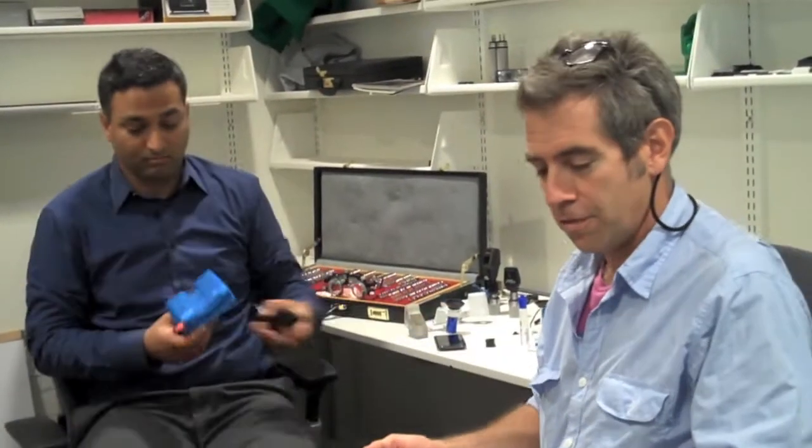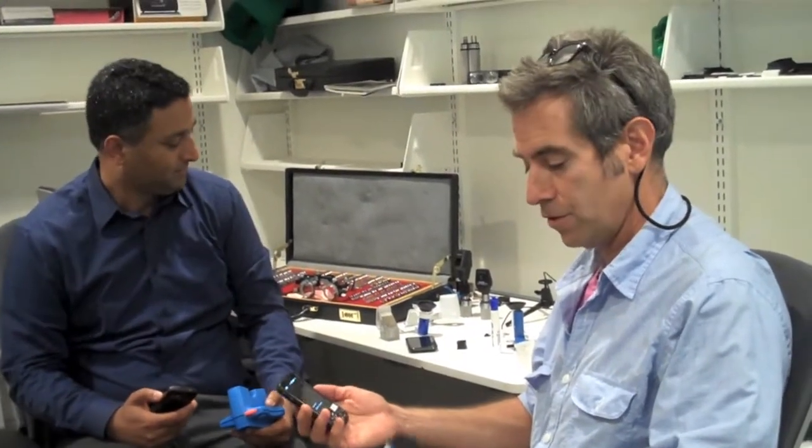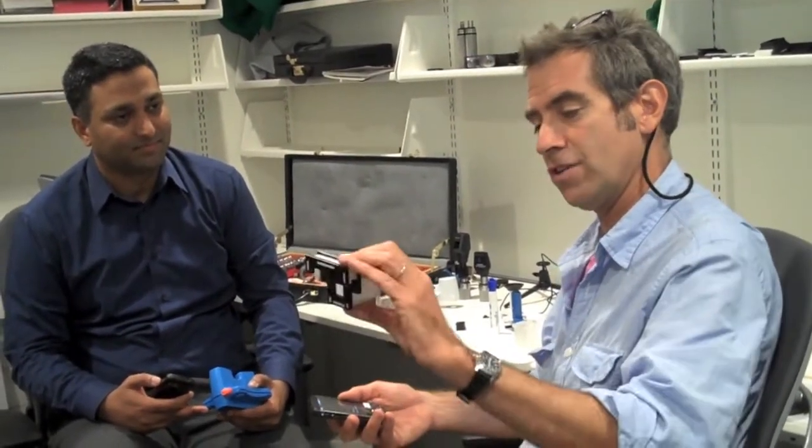I'm here in an office with Ramesh Raskar at the MIT Media Lab, and I'm now going to give myself a vision test with this device they've innovated that combines the technology of a smartphone with a kind of conventional vision test — but this is not a conventional vision test. It's a little piece of plastic that slides over the smartphone, and you're ready to go.